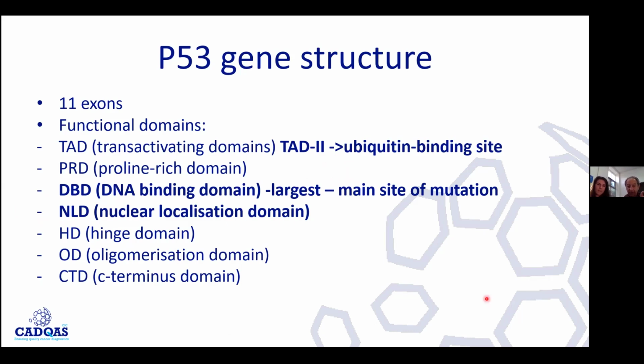So that's a really very, very important point that I think we need to focus on. Normally, even in cells that overexpress P53, if P53 is not mutated, you don't really see staining in the cytoplasm. But when you see cytoplasmic staining, it's almost a telltale sign that there has been something wrong with the nuclear localization domain, so the translocation into the nucleus doesn't happen, and therefore you stain the cytoplasm. And even if there is no nuclear staining, the cytoplasmic staining is a telltale sign. And a note would be that cytoplasmic staining can be very focal.